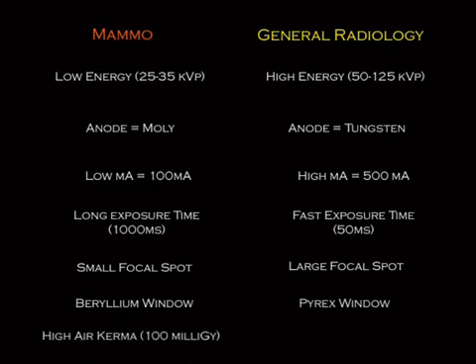And then there's a difference in dose, which is this idea of air kerma, something we can talk about later. But just, there is more dose with mammo because there are longer exposure times, because there's a grid, and all those kinds of things. Okay, that's the end of this talk.